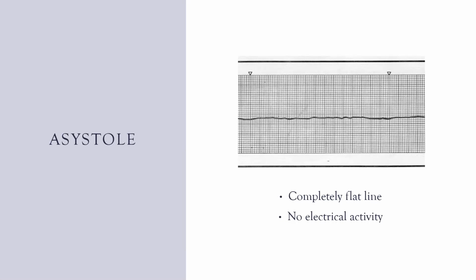If you fail to recognize it for whatever reason, your patient will die and they will eventually lose conductivity of the heart. That loss of conductivity will turn into this, which is asystole, which is absolute absence of any sort of activity. This is a flat line.